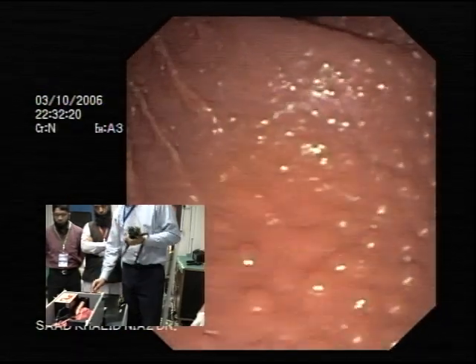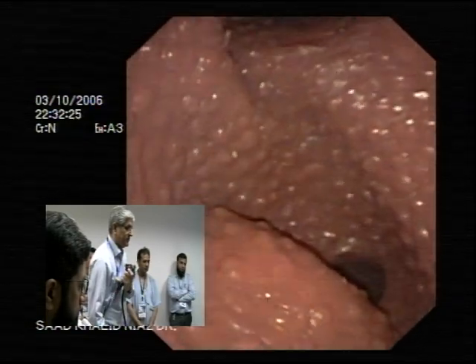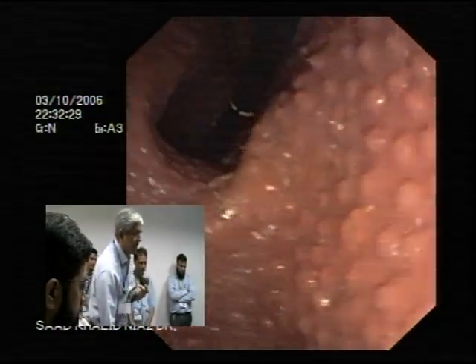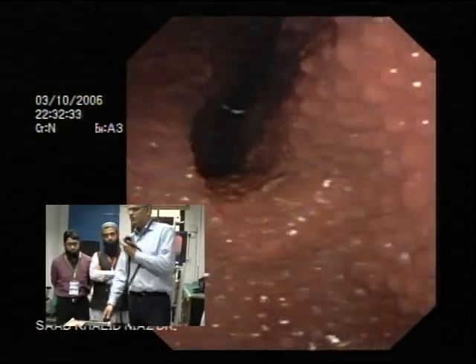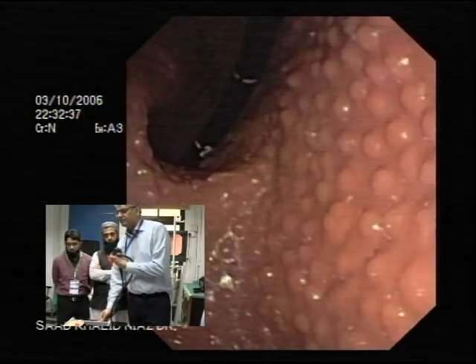That's not bad, I'm not doing that bad. It usually takes half an hour to do this, but this is very stiff. So the idea is we are only showing you the principle of this. The good thing about this is once we've got the pylorus, then hopefully we'll be able to show you.